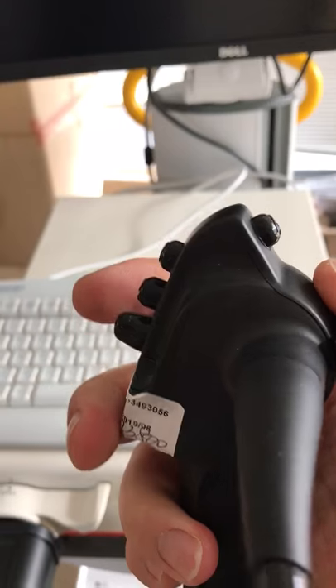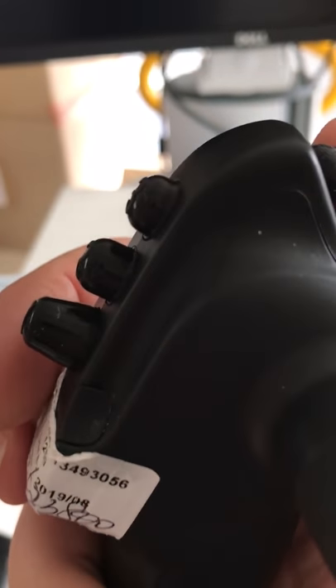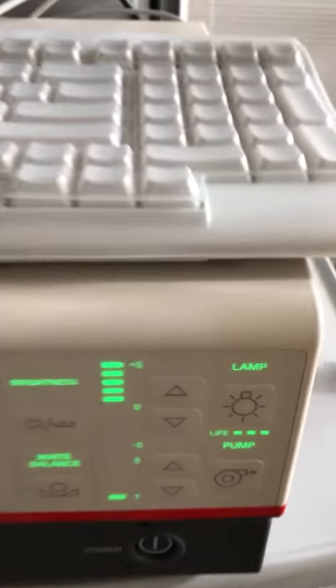You've got four buttons here which we can program to whatever we want — for example, taking an image, freezing, or digital zooming, though digital zoom isn't really something you'd want to use.